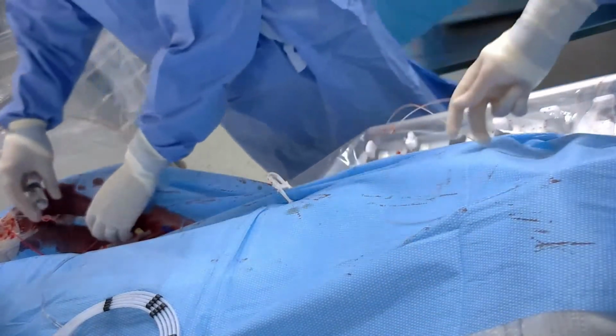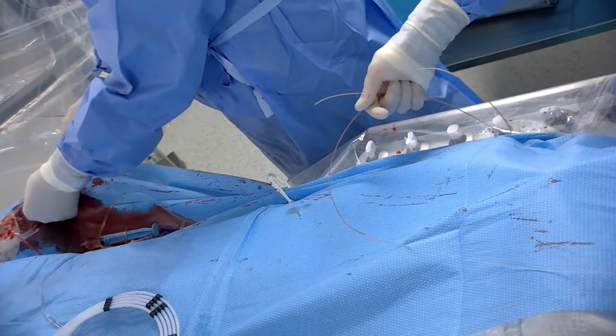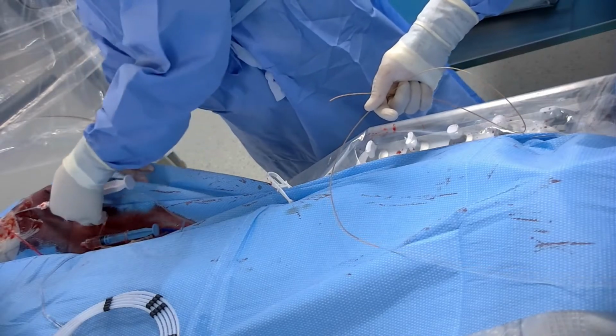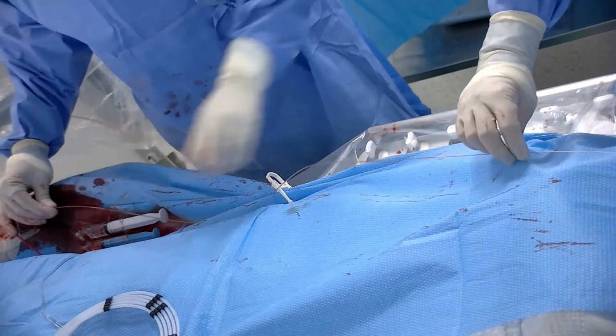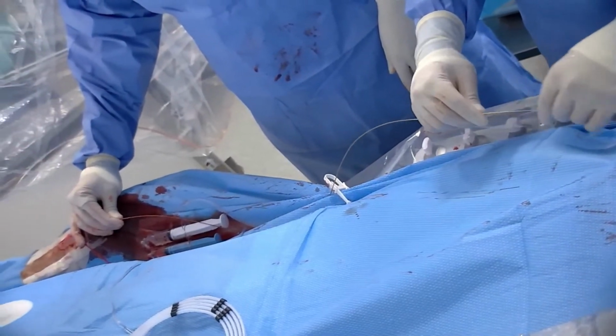So you saw the run, Joji. I think we're in a good spot. We're going to land it here. If a little coil goes right on top of the bifurcation, that's okay. We just don't want it to go further. Yeah. So here we're going to marry the two together, and Ishan's going to help me load it. Yeah, go ahead.